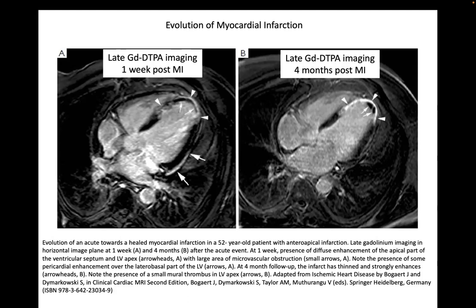As the infarct consolidates and fibroses after the original insult and injury, you get a large volume of much thinner myocardium, which is also kind of stiff, and it's essentially a scar, right? And that shows up as a remarkably bright signal after gadolinium enhancement. And for some reason, the cells that make up this scar retain the gadolinium contrast agent much longer than the normal tissues. So it doesn't flow out.